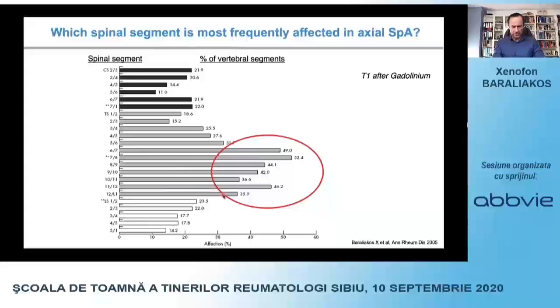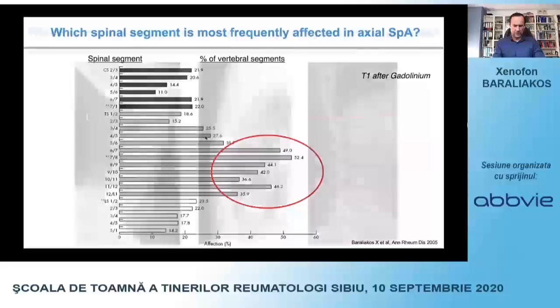And that's something important, because if the patients complain about low back pain, we need to very exactly localize where this back pain is, and do not, for example, do only the lumbar spine, but advise the radiologist to also scan the lower part of the thoracic spine.